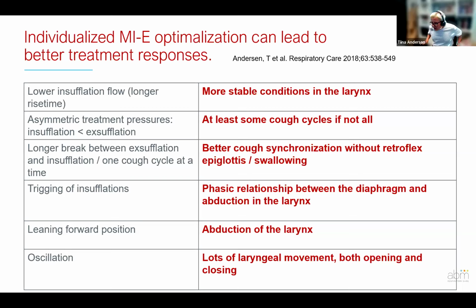And we have seen also in our visualizations that in some patients, the oscillations during insufflation or exsufflation can be beneficial. It's especially so for those who otherwise just have the closure, as you saw in the videos. The option with oscillations can be that they have openings and closures, and at least we get some air in, but it needs to be tried out individually.